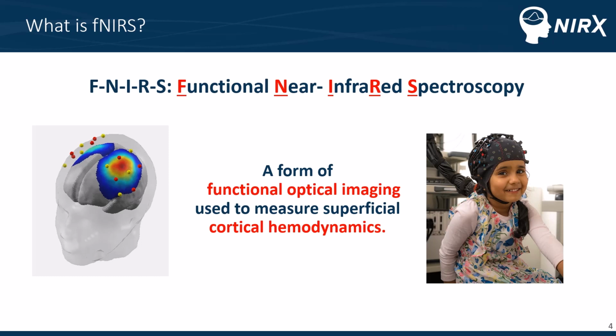And then on the right, we've got an image of a child wearing the cap, so we see the form factor of the technology. It's very similar to EEG, where you've just got probes that sit on the scalp level. It's safe, non-invasive, and comfortable.